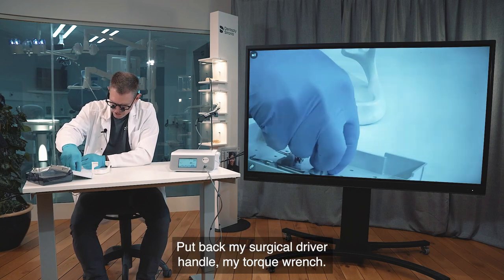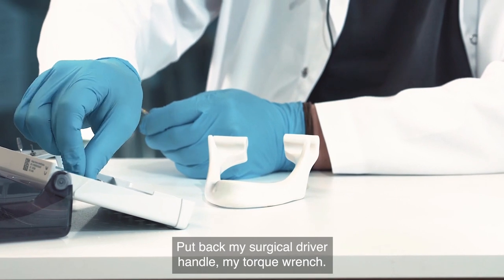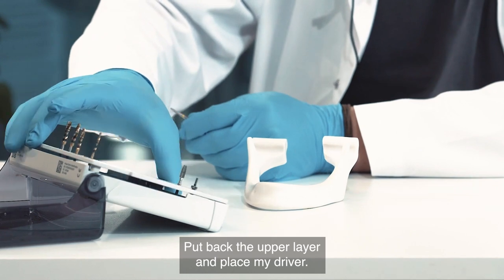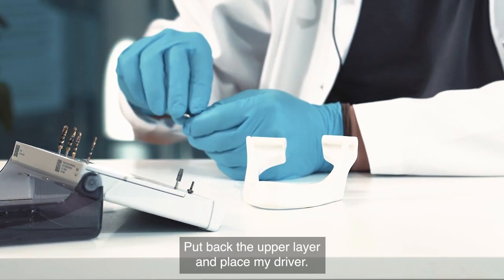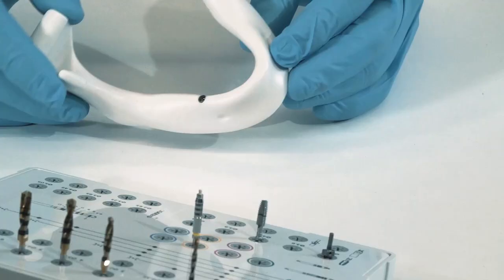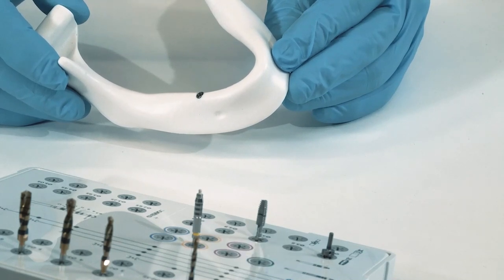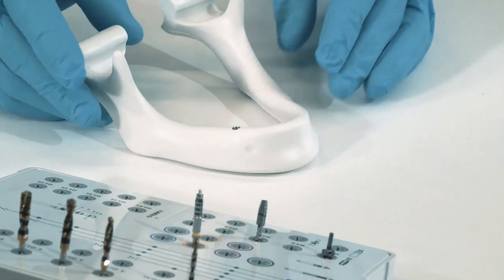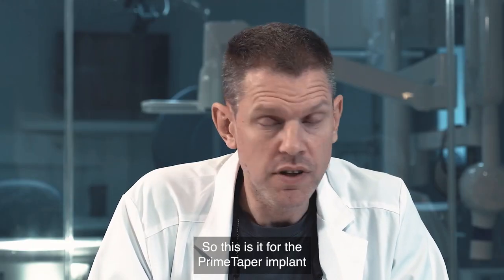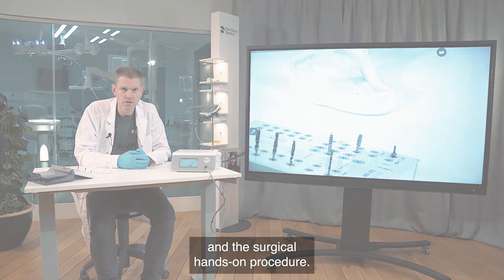I put back my surgical driver handle and torque wrench, replace the upper layer, and place my driver back. Here is the implant in place. This concludes the Prime Taper implant surgical hands-on procedure.